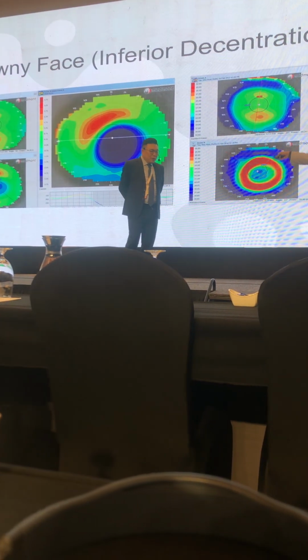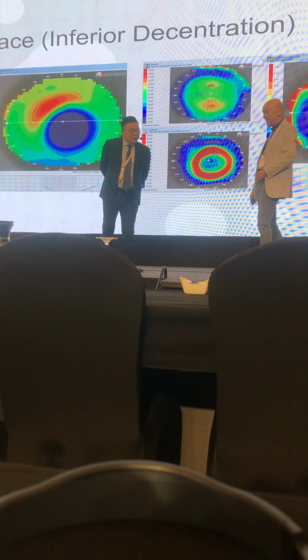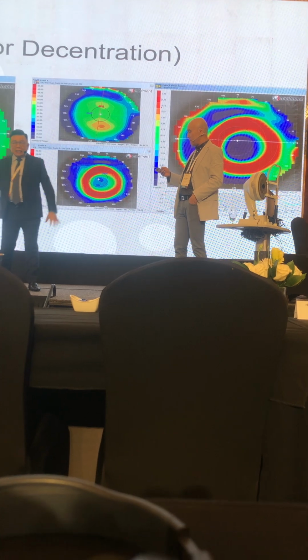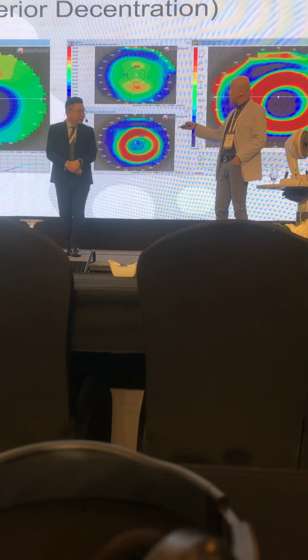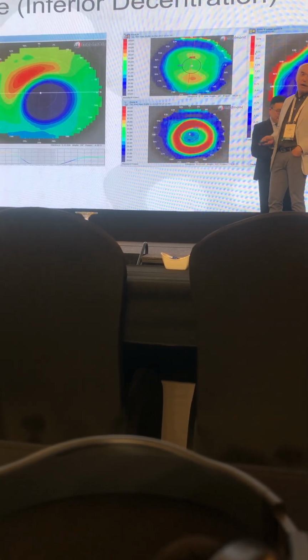So what you need is, I think Steve can handle this. That's why we look at what we call fluid dynamics. And that's why we Asians have Tai Chi, trying to get things balanced, so we can get a lens nicely centered. The important part is to make sure the corneal integrity is in good condition. So you can solve it by customizing lenses. We try to do that.